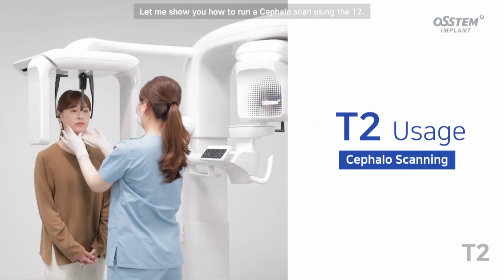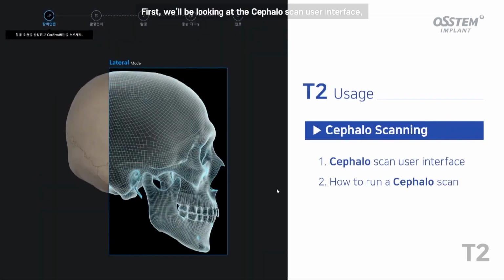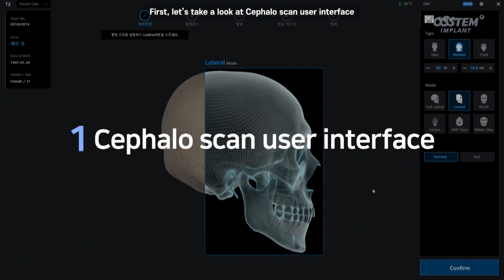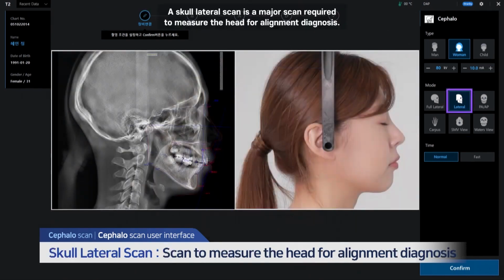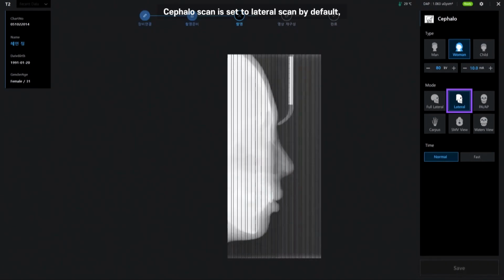Let me show you how to run a cephalo scan using the T2. First, we'll be looking at the cephalo scan user interface, and then how to run a cephalo scan. First, let's take a look at the cephalo scan user interface. There are 6 scan types available in cephalo scan mode. A skull lateral scan is a major scan required to measure the head for alignment diagnosis. It helps observe any changes in the face. Cephalo scan is set to lateral scan by default.